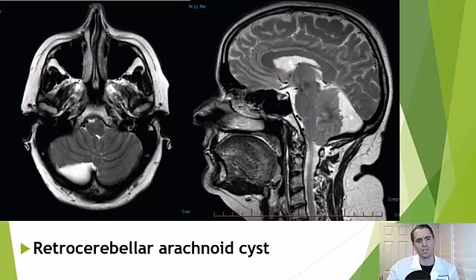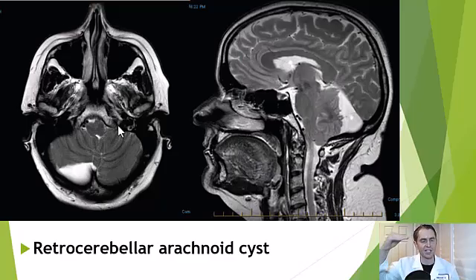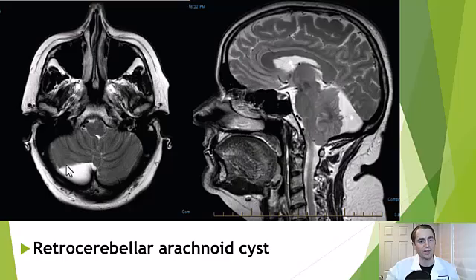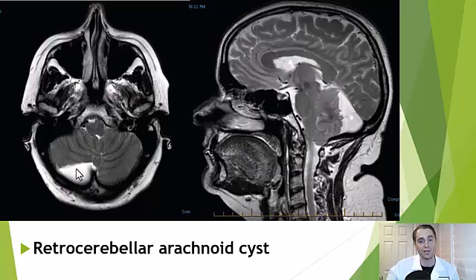These are fluid-filled spaces underneath the arachnoid matter, part of the meninges or coverings of the brain. On the left, you're looking at an axial image through the head. Here's the nose, and these are the ears. This is the medulla, and this is the cerebellum. You can see this T2 bright fluid-filled structure, which is a retrocerebellar, or behind the cerebellum, arachnoid cyst — a very common location.